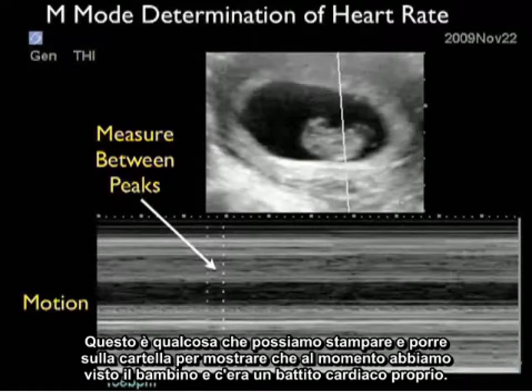This is something we can print out and place on the chart to show that at the time we saw the baby, there was an actual heartbeat.